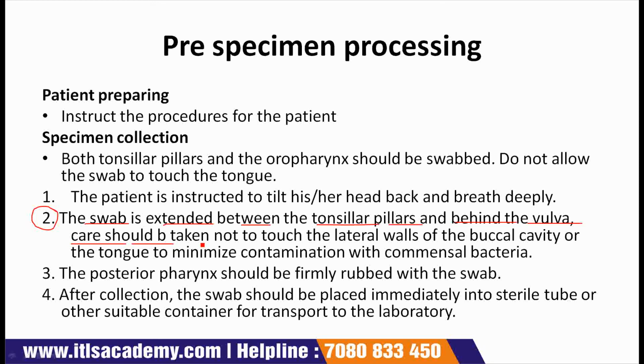Care should be taken not to touch the lateral walls of the buccal cavity or the tongue to minimize contamination with commensal bacteria. Point third is: the posterior pharynx should be firmly rubbed with the swab.